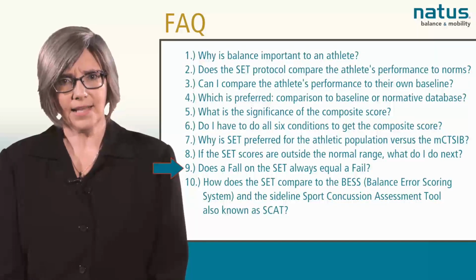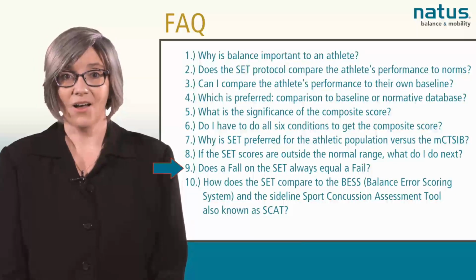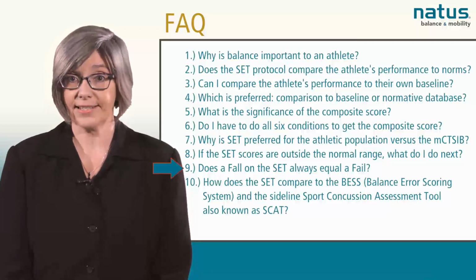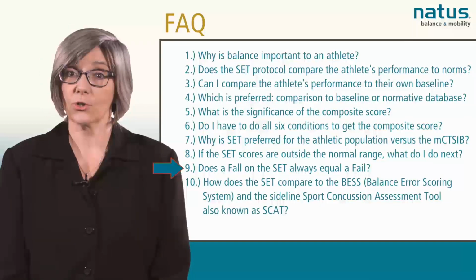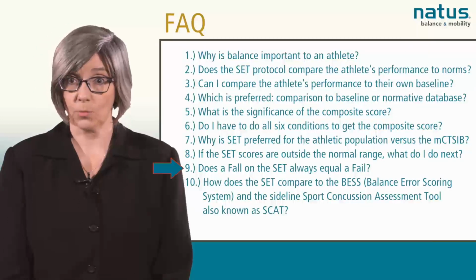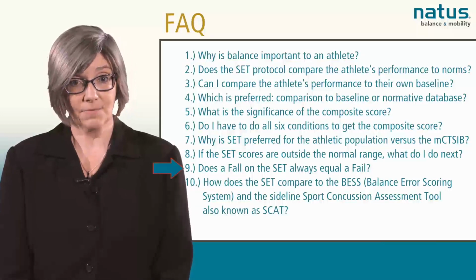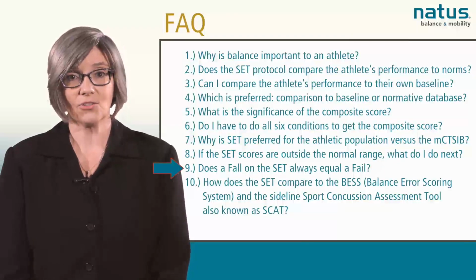Does a fall on the SET protocol always equal a fail? A fall on the SET does not always equal a fail. When conditions are very challenging, such as in conditions 5 or 6, many normal individuals have difficulty maintaining balance for the entire 20 seconds of the trial. A fall during these conditions may be scored as normal performance based on data from sway velocity measures as well as the length of the trial.